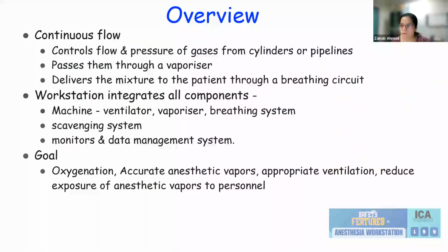So now, just to give you a brief overview, I'm sure all of us are already familiar with the workstations. We know that these are continuous flow type of workstations, and they control both flow and pressure of gases from cylinders or pipelines which supply these gases to the patients. These workstations pass them through a vaporizer and deliver the mixture to the patient through a breathing circuit, right? So now what is the difference between a Boyle's machine and a workstation?